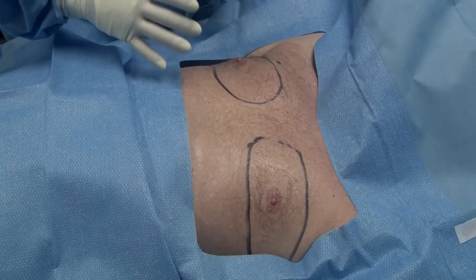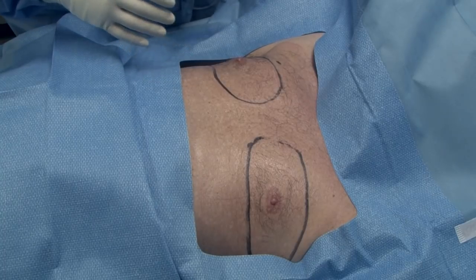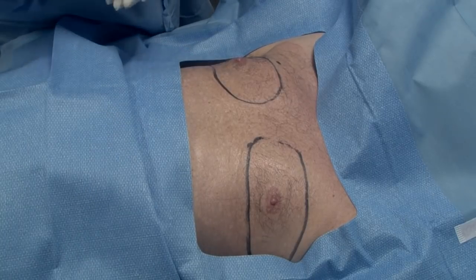As you can see, I've already marked the area we're going to work on first. This is a male chest. We're going to start here and then we're also going to do flanks.